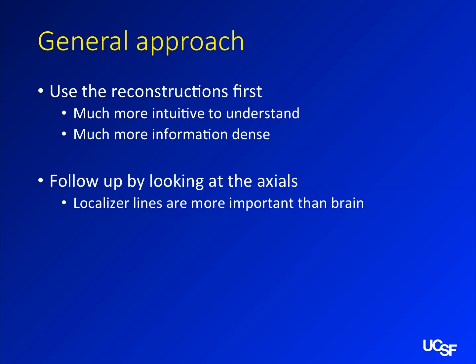And then don't forget about the soft tissues. It's very important to not miss a thyroid tumor, a renal tumor. If you're doing an MR of the L spine for degenerative disease and someone has renal cell carcinoma, that's another way to end up in the defendant's box.